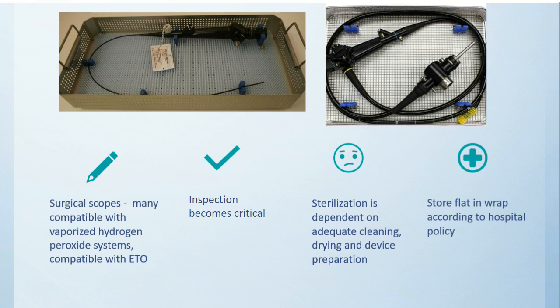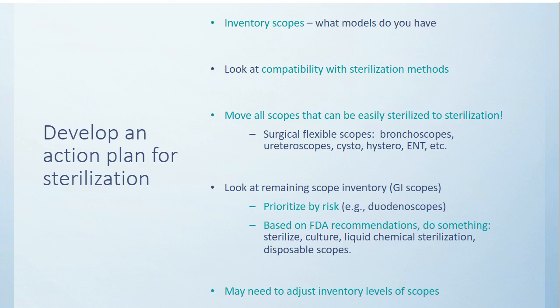We still need to focus on adequate cleaning and drying and preparation and inspection. That doesn't go away because we've moved to sterilization. But what's great about sterilization is we get a wrapped item that can lay flat in its wrap per your hospital facility. So we don't have to process them as often. So this I've already touched on.